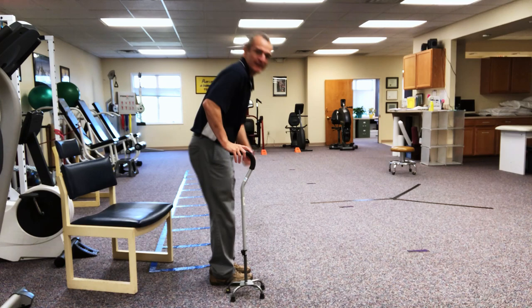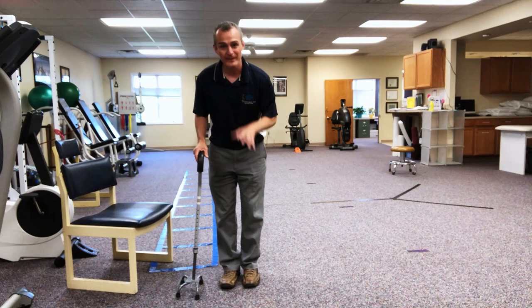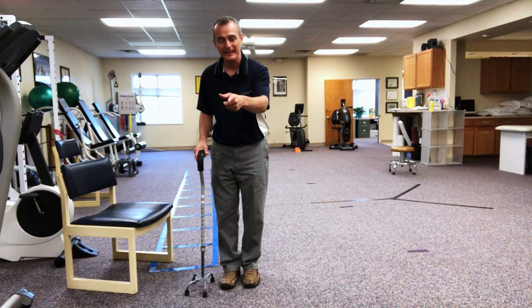With my hand resting on the cane, it's comfortable — there's a little bit of bend in the elbow. I'm not craning up or bent over; I'm just in a neutral position. So assuming a left knee replacement, whether using a quad cane or a single-point cane, the typical sequencing is: the surgical side leg and the cane move forward together, then the non-surgical leg pulls all the way through.